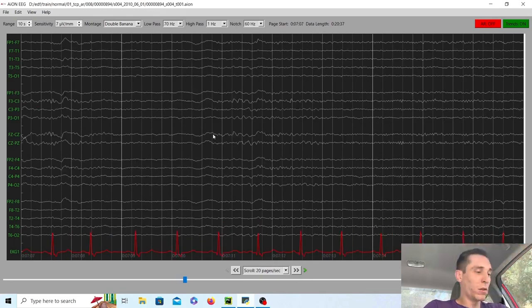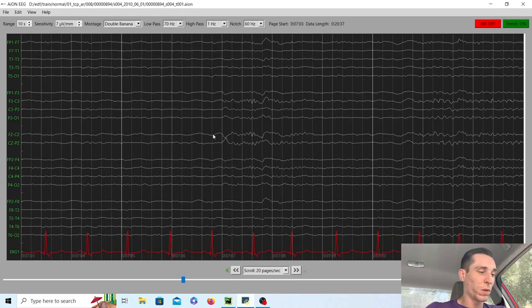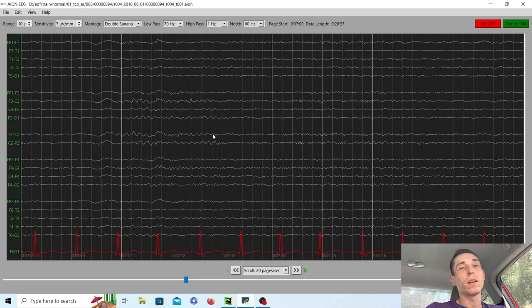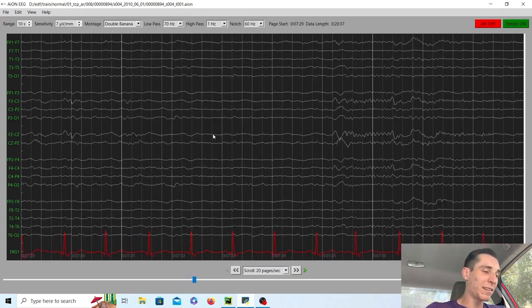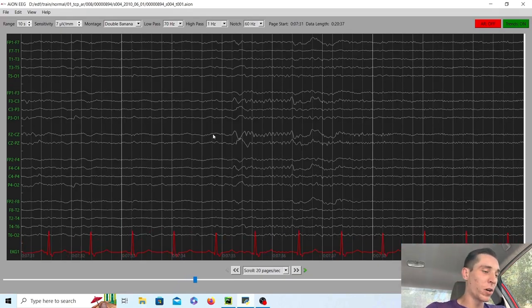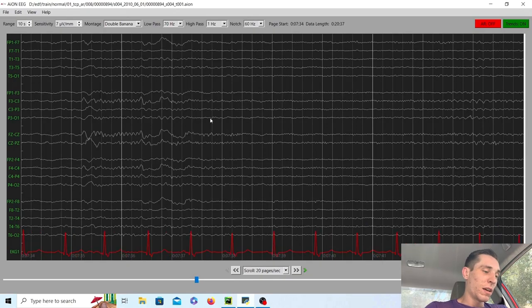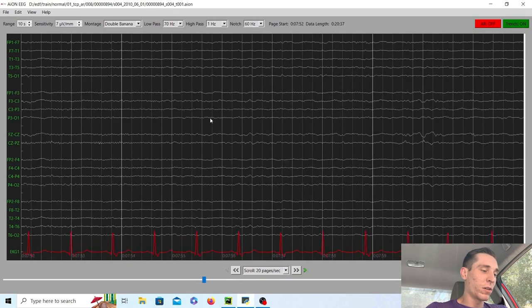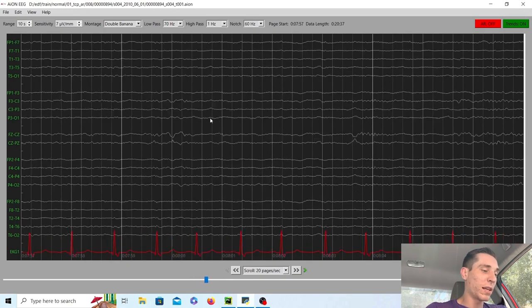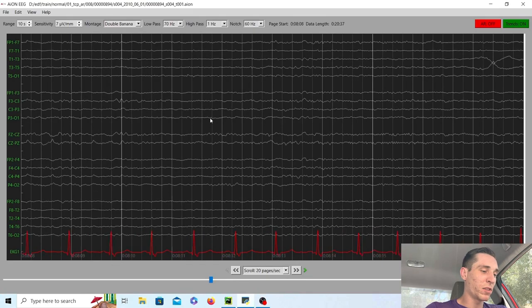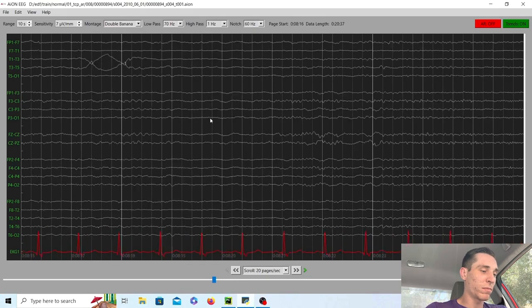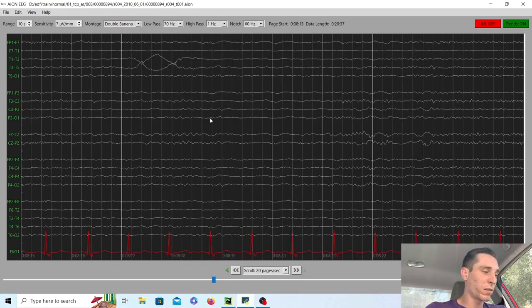How do you know you're in stage two sleep? Well, sleep spindles guys, that is essentially the hallmark. And you can also see these vertex waves. And there's also a thing called K complexes, but in this patient, I don't see any of those particularly.